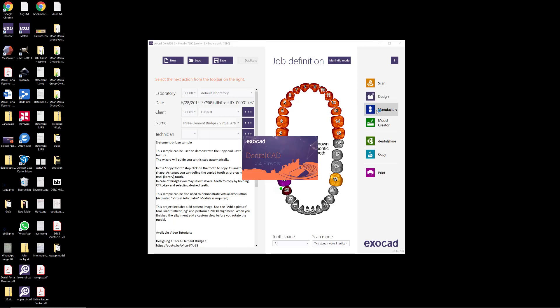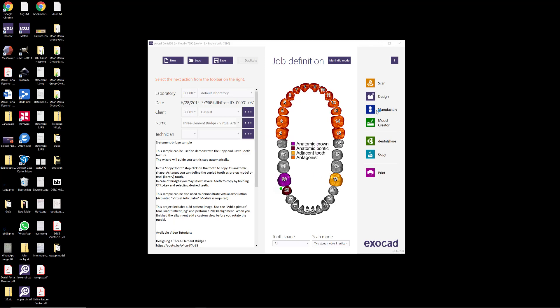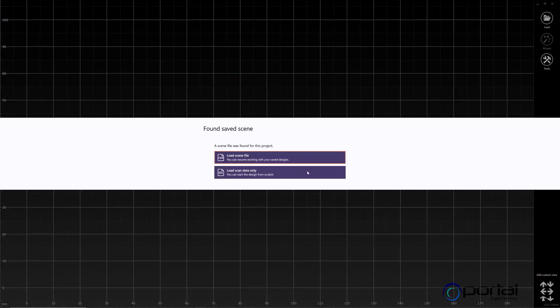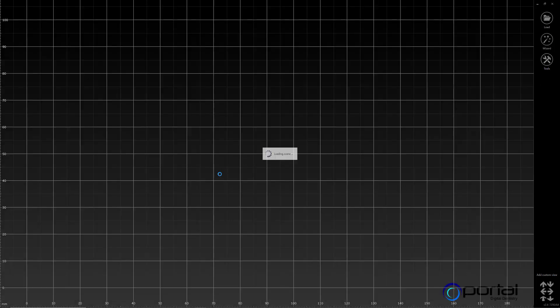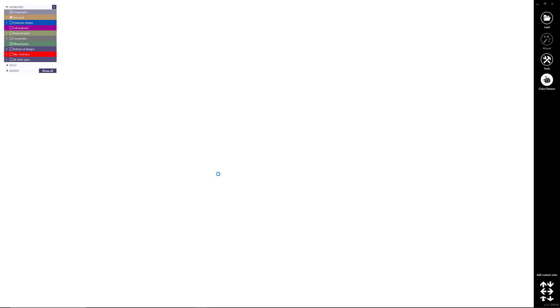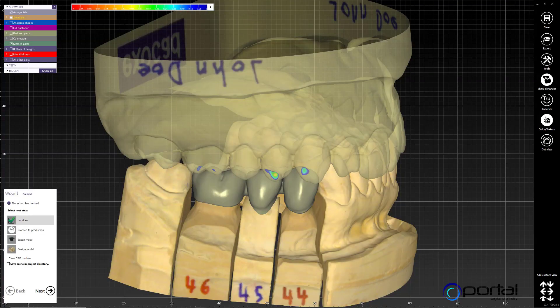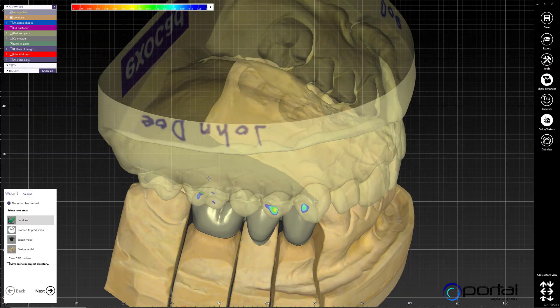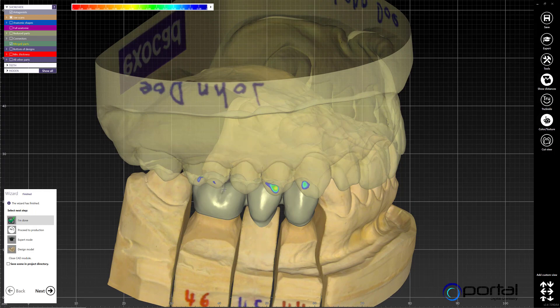Say in this case the doctor decided they're just going to pull the distal molar that already exists in the patient's mouth, and they want to extract it from the scan data and then add an extra molar here.